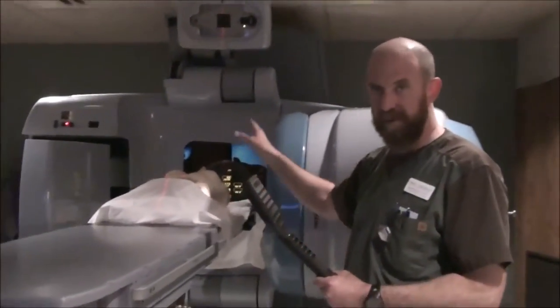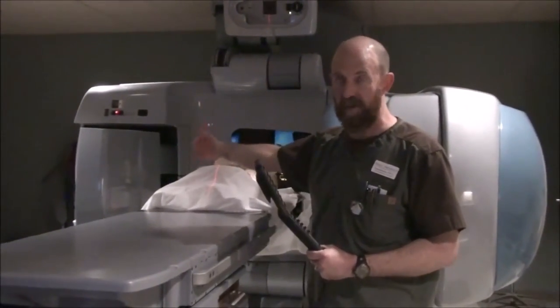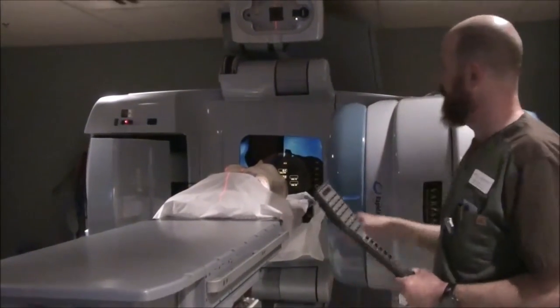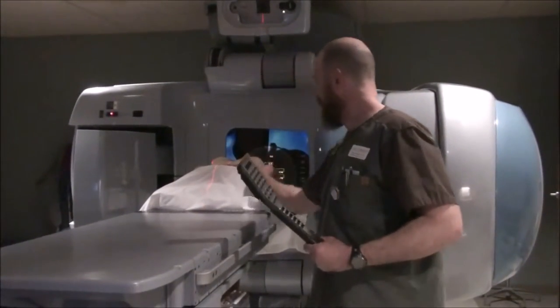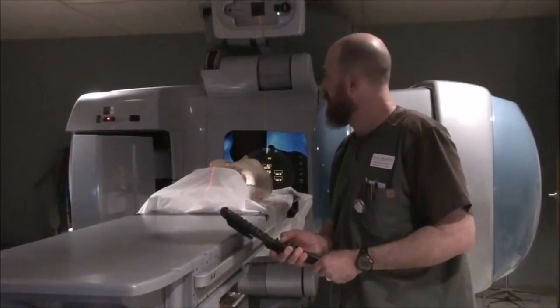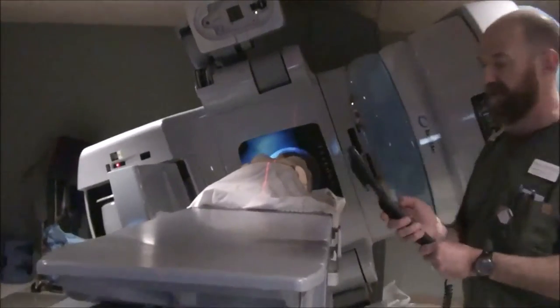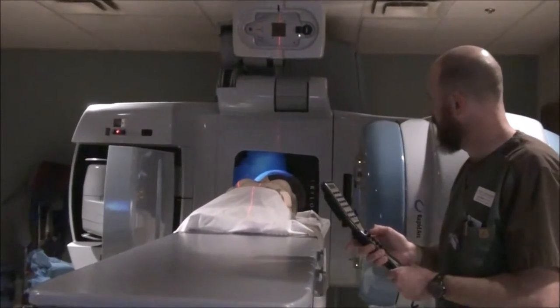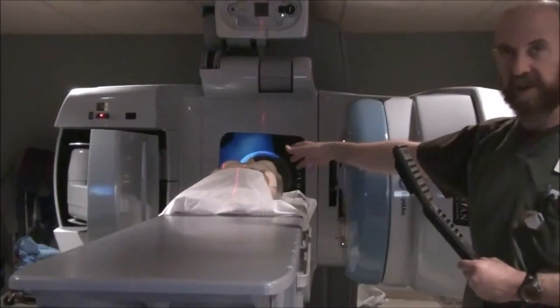Now we've got all our information written down — gantry, table, and collimator from the anterior, and gantry, collimator, and table from the lateral. We've got this person set up in three points — a 3D set. Once you've done that, come in and mark both lateral sides, then rotate up, get the image intensifier out of the way, and mark the other side. Rotate back over, notate your SSD, and read your SSD. Now we're ready to take a film.